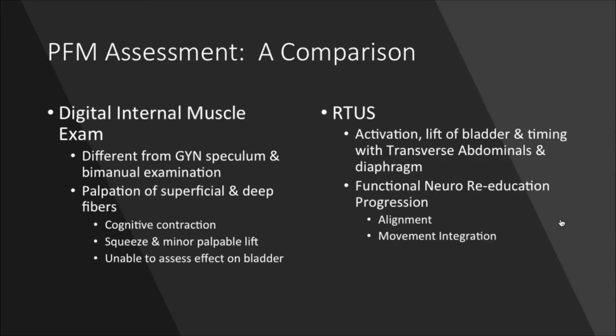From a big picture perspective, we're looking at intra-abdominal pressure control, breath, posture and alignment, hip and spine contributions, and, as Megan mentioned, the neurological system that could result in overactivity of muscles, and movement. Locally, we're going to assess the pelvic floor via palpation, whether external or internal, depending on the patient population, utilizing real-time ultrasound imaging to help decide whether we're dealing with overactive or underactive muscles, looking at the contraction and relaxation capabilities.